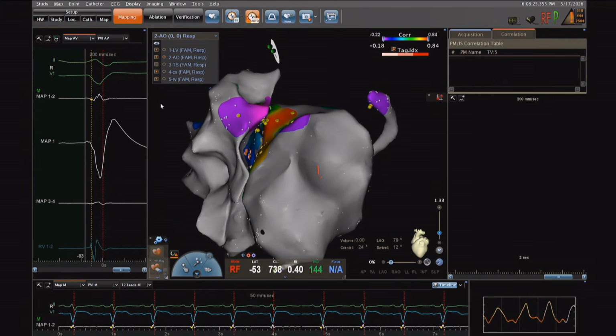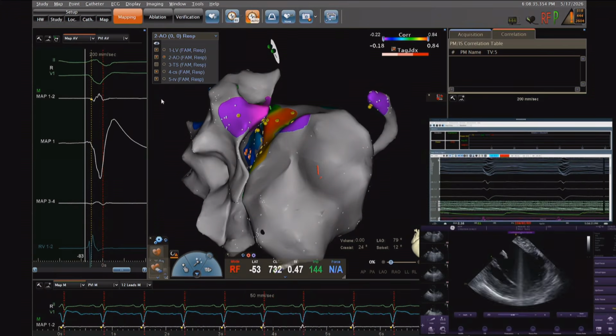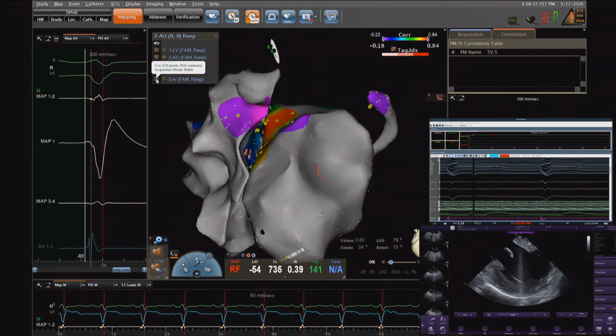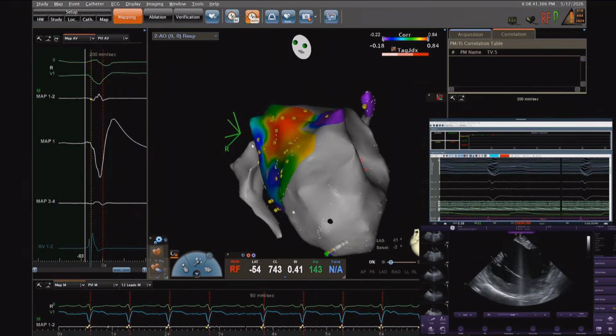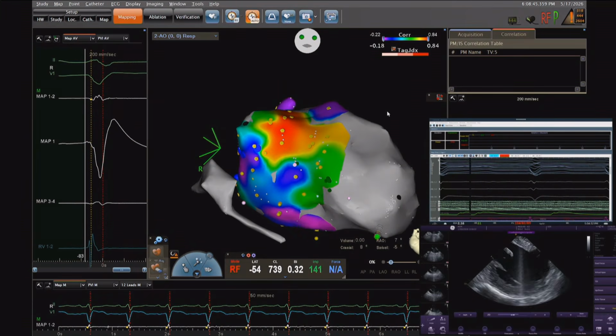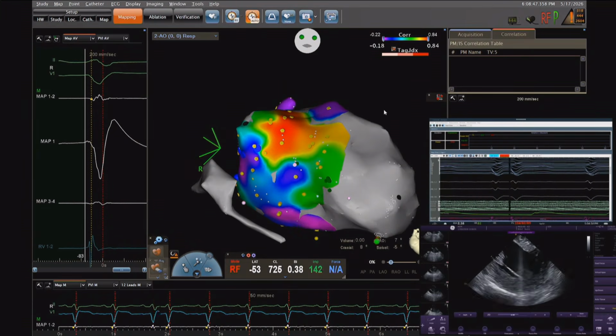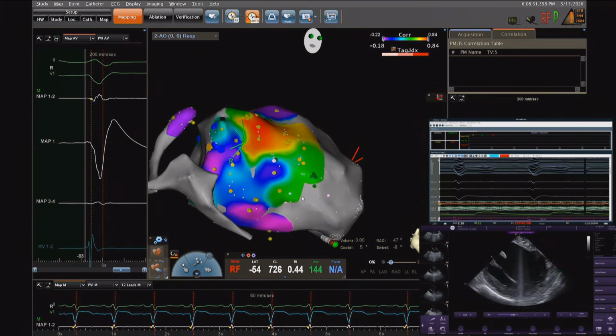But anyway, besides this arrhythmia, I think we definitely will go to this apical aneurysm because there are late potentials. There is slow conduction. There are channels of slow conduction in that big apical aneurysm. We showed you that in the image of intracardiac echo. So you see it also here on the map that there is a huge aneurysm, anteroseptal and the inferior wall.